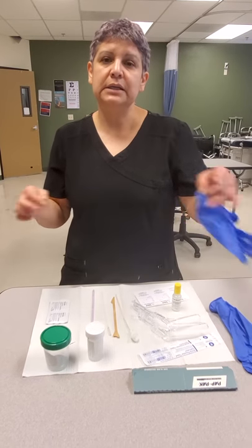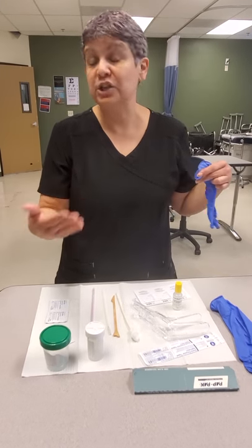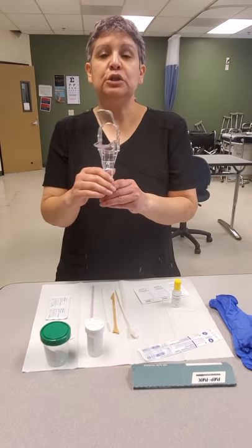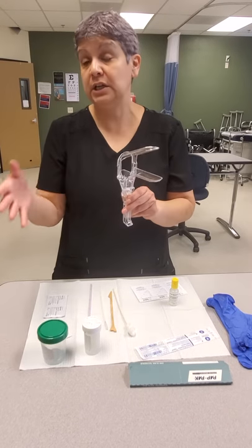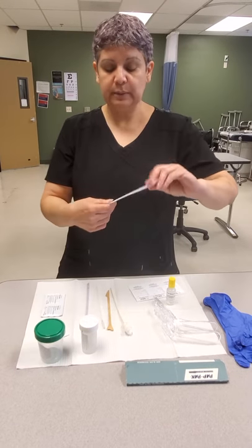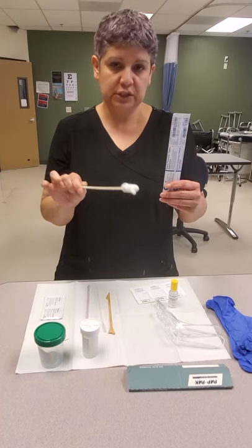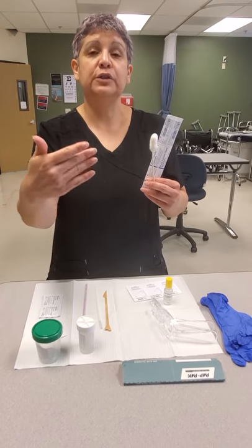Once the rectal exam is done, the provider will peel off that glove to continue with whatever process in the pap smear has not been completed. The vaginal speculum is used to open up the vaginal canal so the doctor can visualize the cervix. Doctors will use either the cotton tip applicator or the pom-pom to remove excess vaginal discharge to allow better visualization of the cervix.